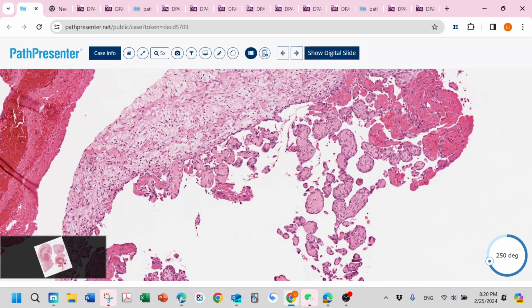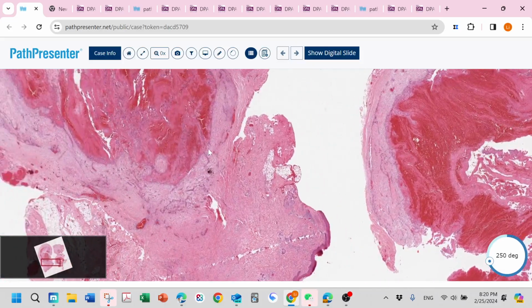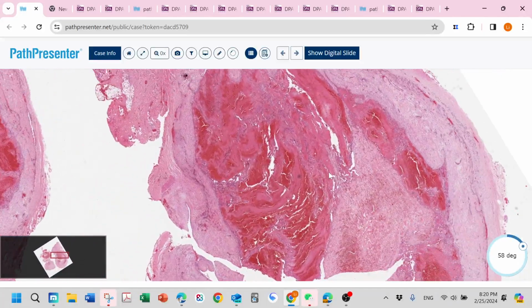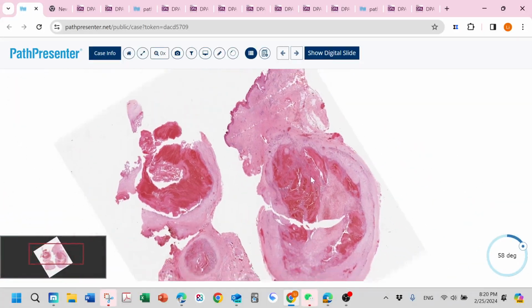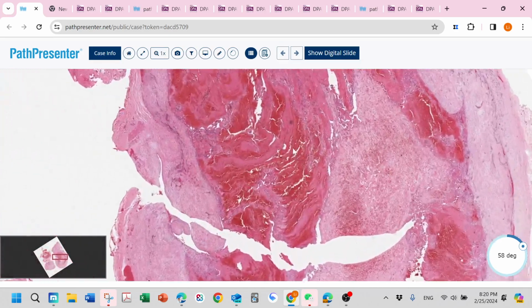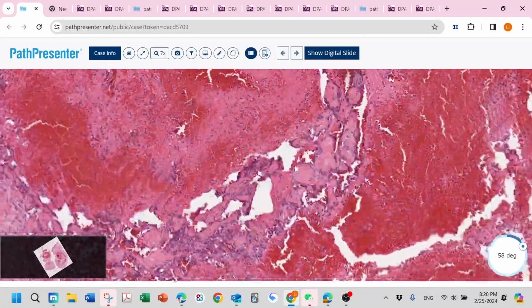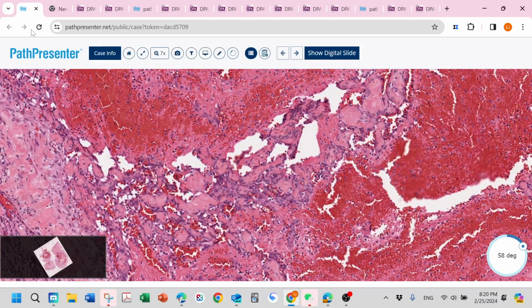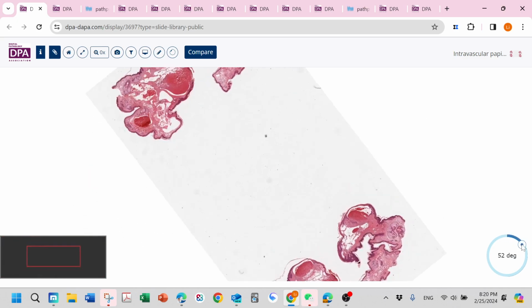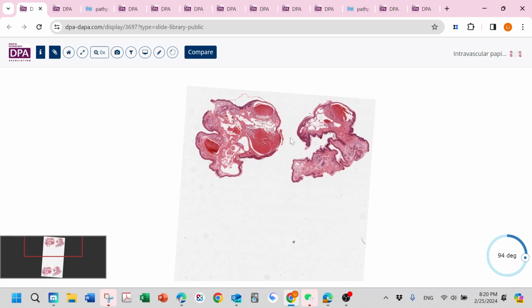See this papillary structure, but it is just recanalization of a big thrombus in a big vessel. For this one also the same, a really big vessel that just gets a big thrombus, this fibrin deposition. Then these endothelial cells just try to grow inside to dissect this big thrombus and form this papillary structure. This is another Masson tumor, papillary endothelial hyperplasia.